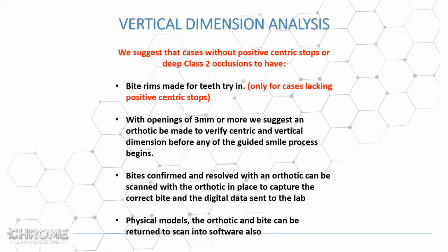So this seems to be the biggest issue we have with these cases, especially double arches, but even on single arches we have it. The second biggest issue we have with these cases is bites that are not correct when they come in. Like I said earlier, we have about an 80% rate of cases that come in where we're lacking some sort of information that we have to get. That's why I say the facial analysis needs to be done before anything is sent to us, and done properly, so that when we get the case, we can continue on with it and not have to stop for this or that. We would think that adds more length to the finish time of the case, but usually it doesn't, because doctors don't necessarily want to change surgical times for various reasons, and we start running out of time and still have to get the case done.